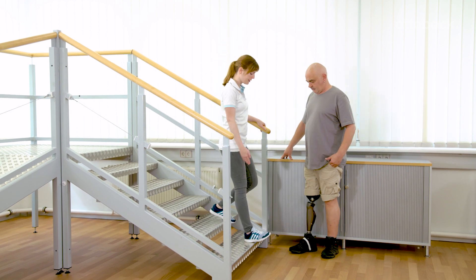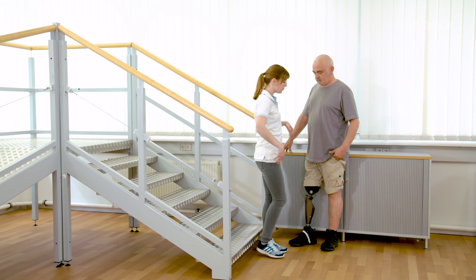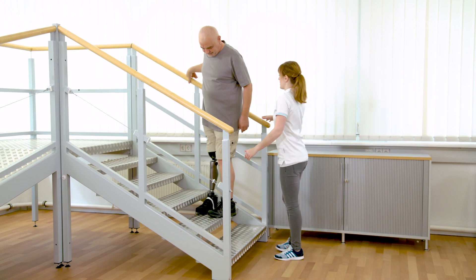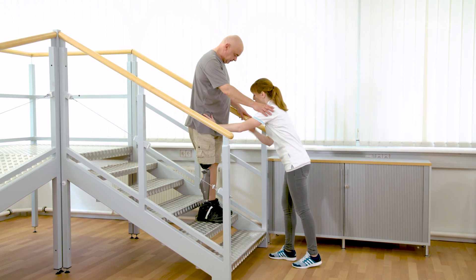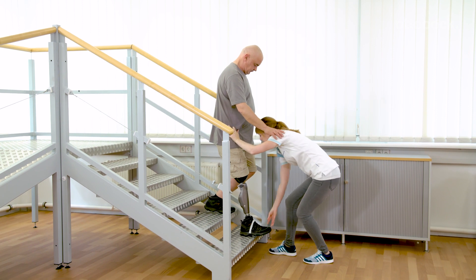Proper foot placement is also important for walking downstairs step over step. Start the training on the contralateral handrail and make sure the upper body stays upright. If necessary, Gerhard can use Franziska's shoulder for additional support. In the beginning, Franziska guides the foot placement.